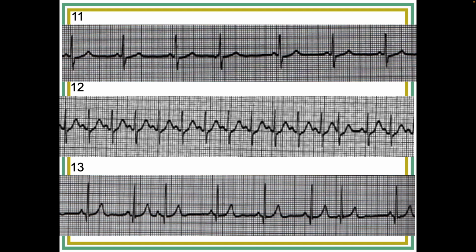Okay, final one. So, Ann, why don't you do it? Okay, that was sinus rhythm around 70. Okay, and there are 2. And where are they, please? Okay, and just remember, you might have said it and I might not have heard, when you have a sinus rhythm, you can say sinus at a rate of 80, that's fine, that tells you what it is. The other way to say that is normal sinus rhythm.